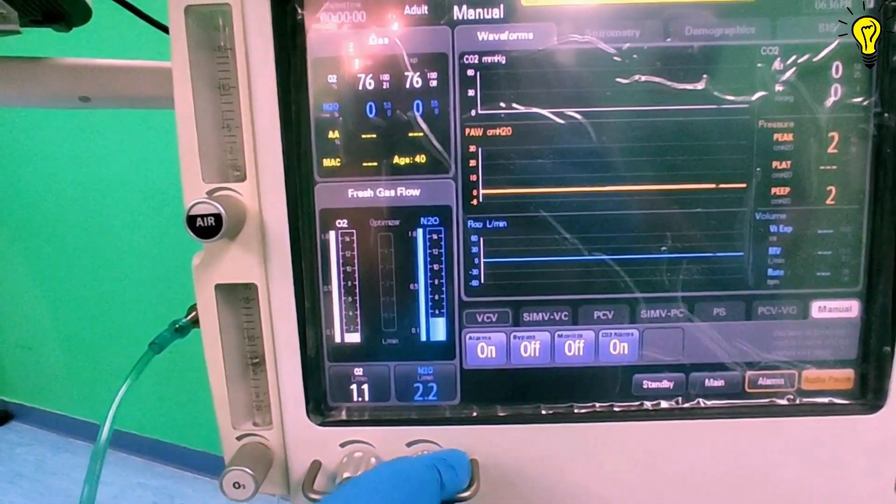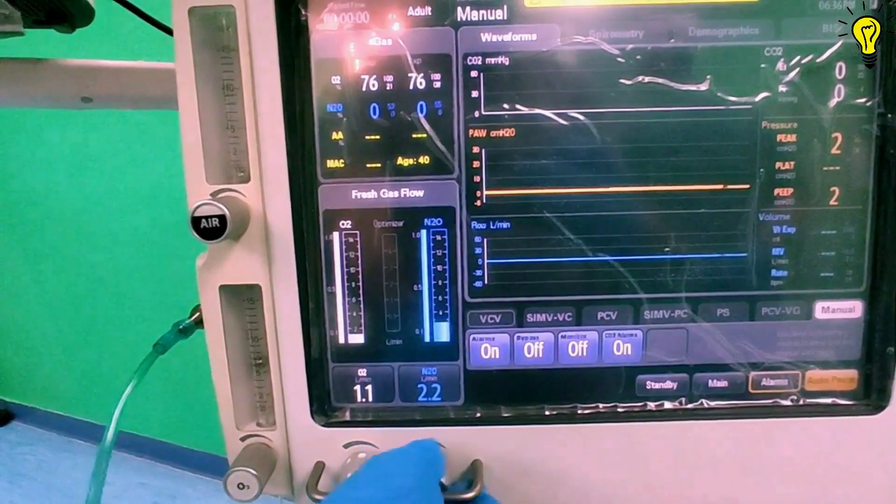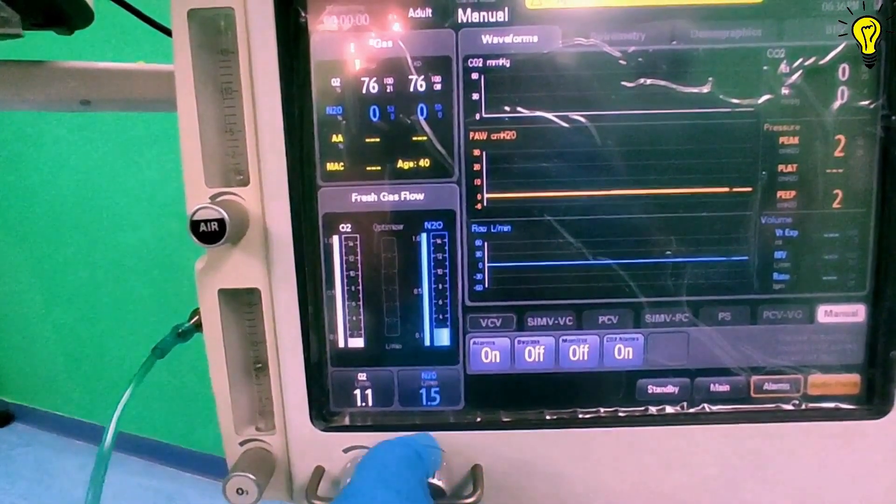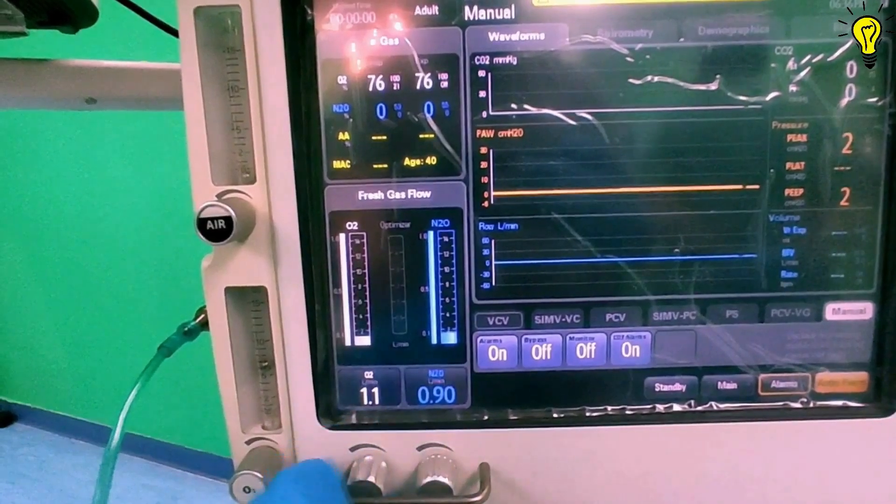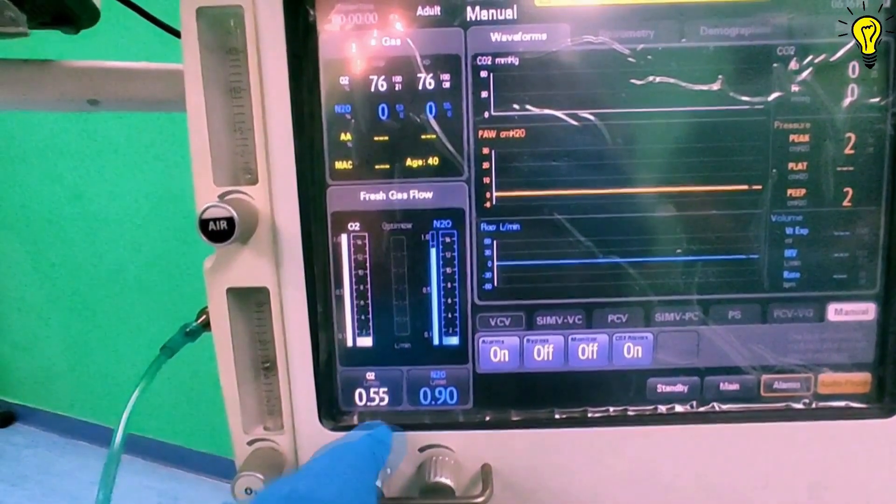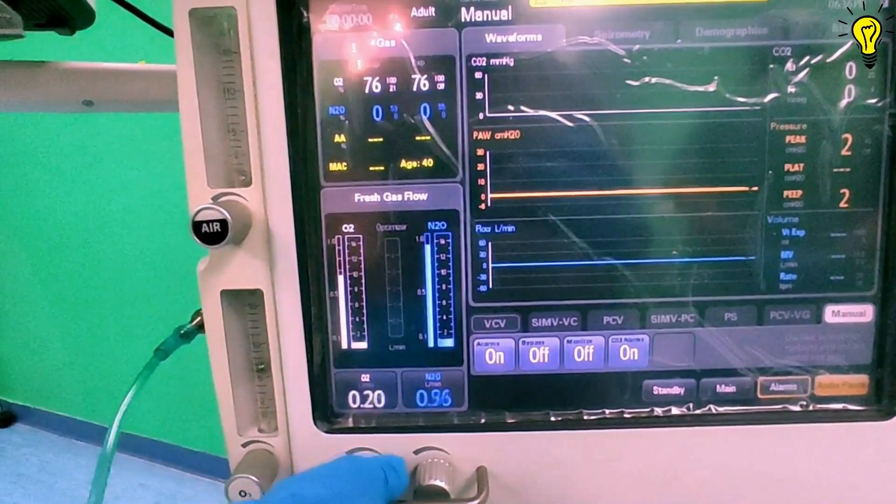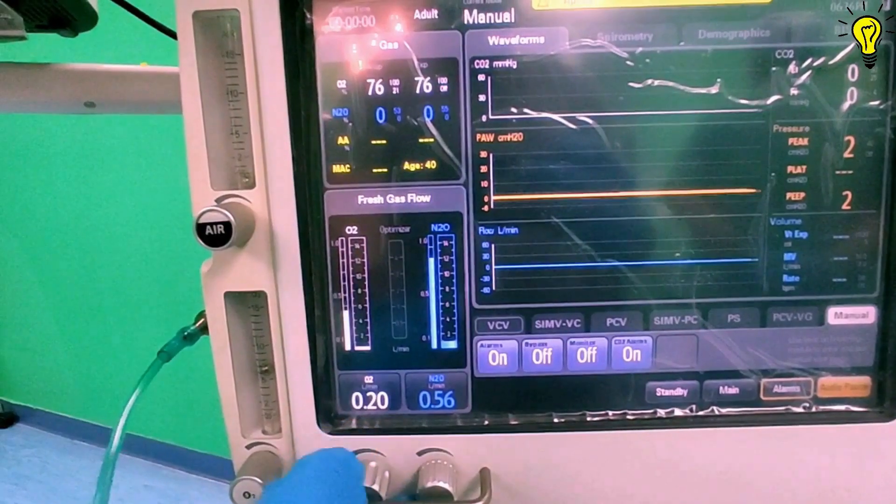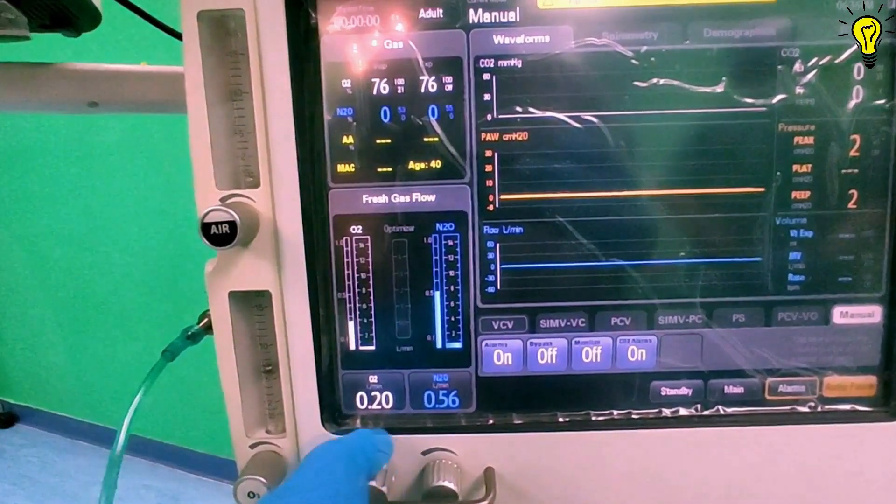So the SORC of Dragger stopped nitrous from increasing further. But the ORC of this Mindray machine instead lets us increase the nitrous but also automatically increases the oxygen. Overall, the key being ORC maintains this ratio at 3 ratio 1, minimum.